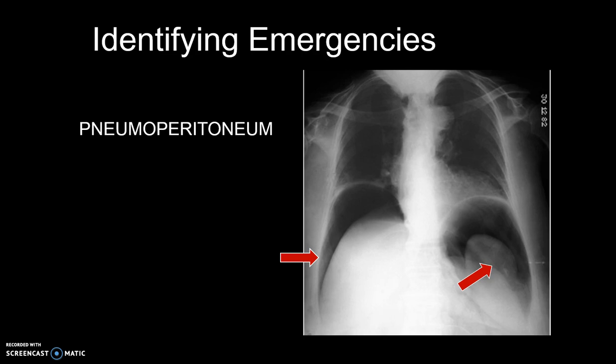This patient has a large volume of free gas under the diaphragm. Dark crescents have formed separating the thin diaphragm from the liver on the right and the bowel on the left. This patient had a perforated duodenal ulcer.